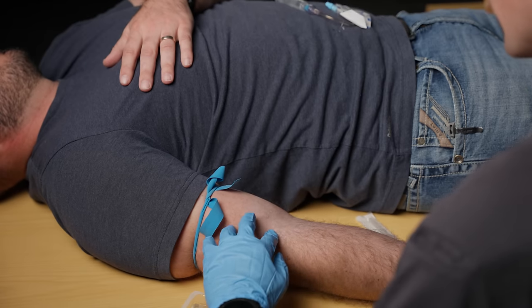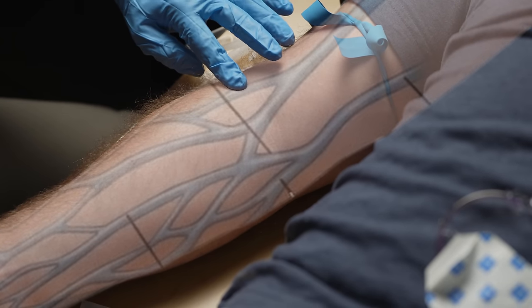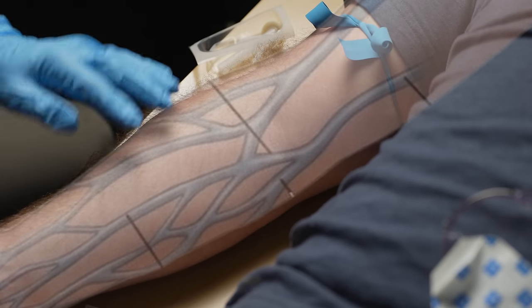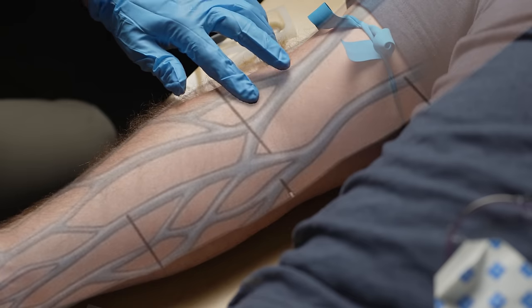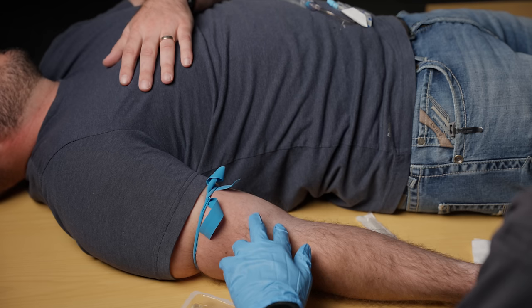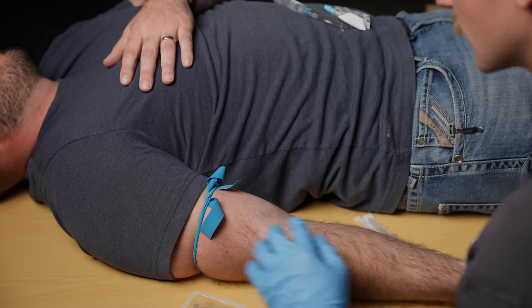I'm going to get an idea of what I want to start here. Everybody has veins in their AC and the anatomy is relatively similar so this is a good place to start. Veins that you can feel are far better than veins that you can't feel. If you can see something but it doesn't have any bounce to it, it's not always your best bet for an IV start.